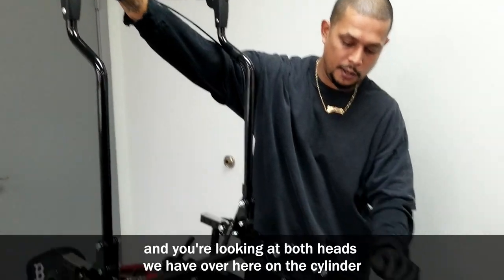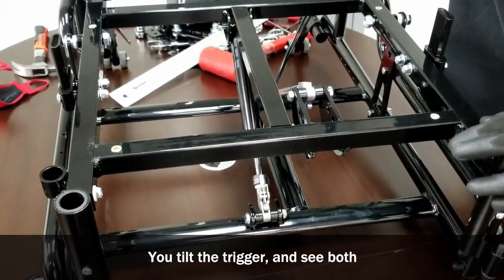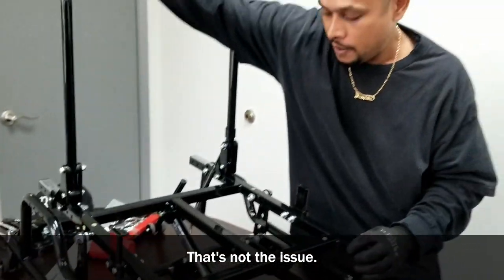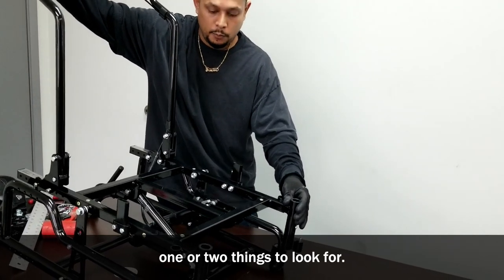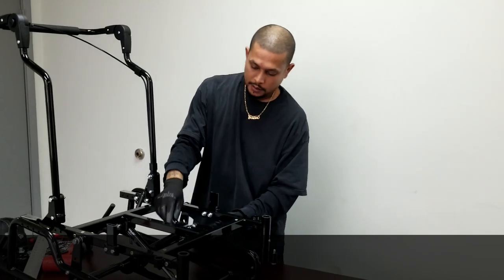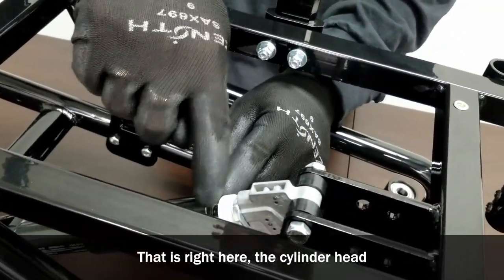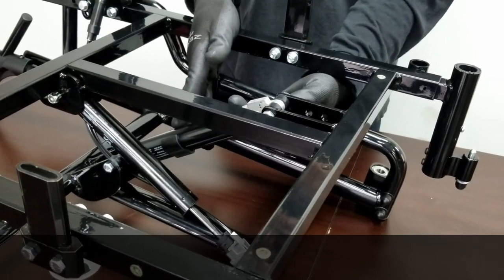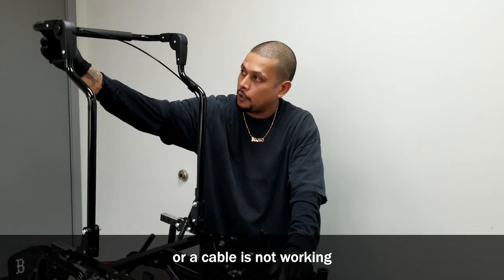The second thing is if you're squeezing the trigger and looking at both heads — cylinder one and two — tilt the trigger and see if both heads are moving at the same time. If they are, the cable is fine. If you keep tilting the trigger and the chair is not moving, look for one or two things: the seal around the cylinder head is most likely leaking, right here on both cylinder heads, or there's a malfunction somewhere inside the cylinder. These are the things to look for when the cylinder or cable is not working.